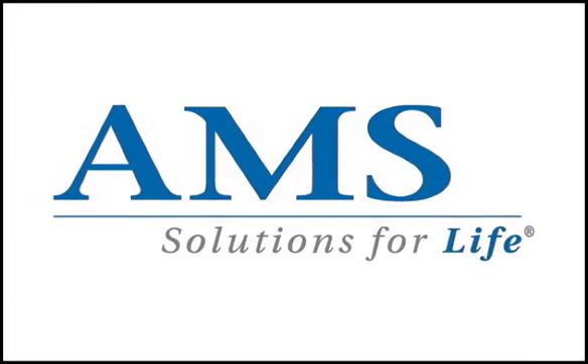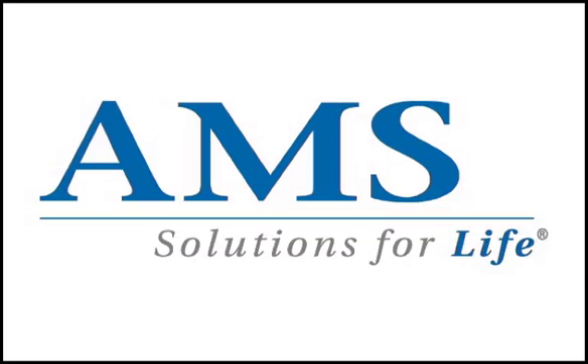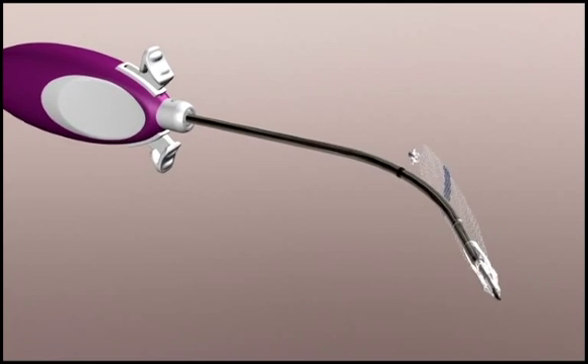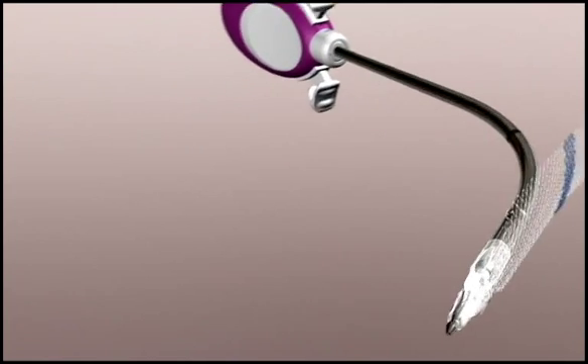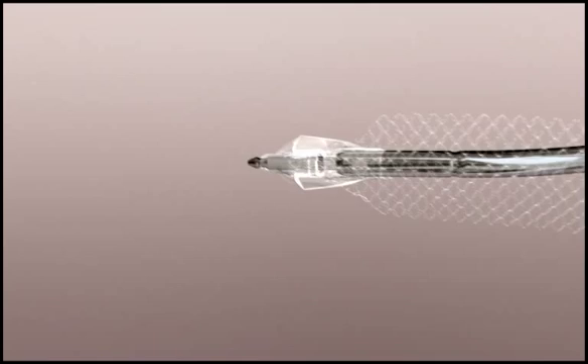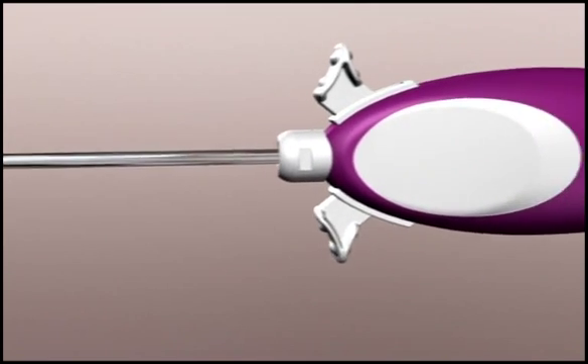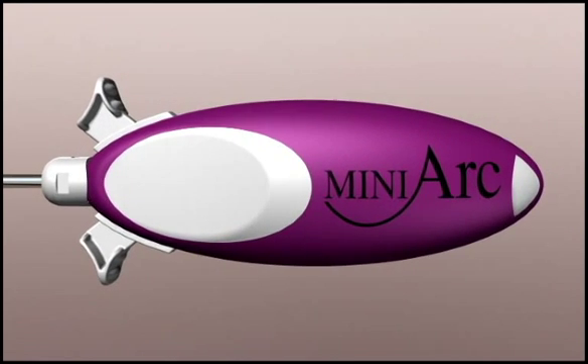American Medical Systems presents the next generation in the Mini-Arc sling family system. Mini-Arc Precise is the next generation in the Mini-Arc sling family. With the same safety profile as the original Mini-Arc, the next generation Mini-Arc Precise is designed to offer more precise delivery and control.